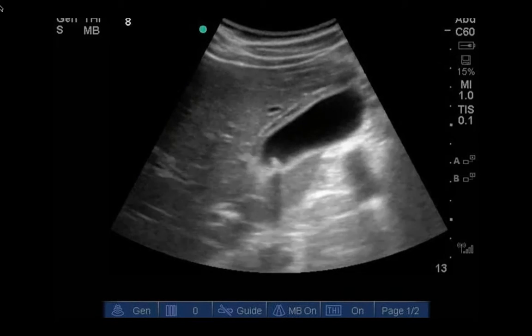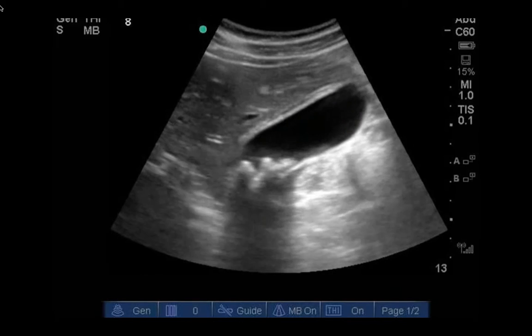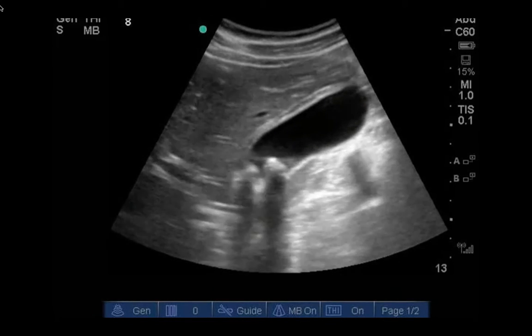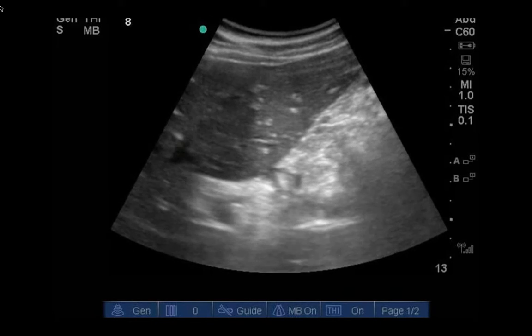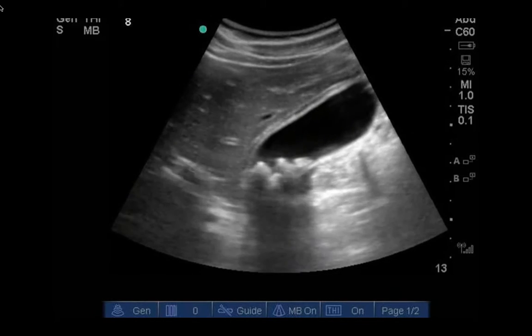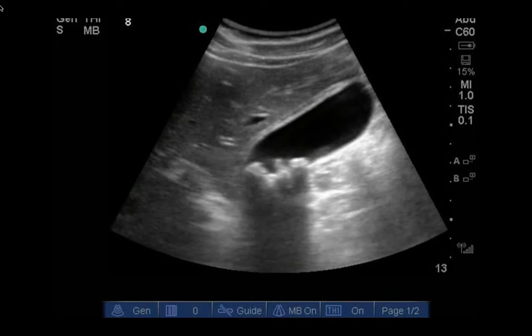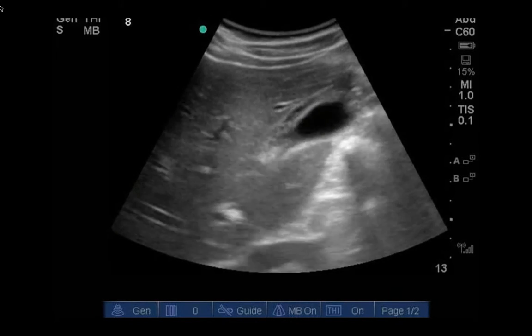And here is yet another example of acute cholecystitis. You can imagine that if you see this on bedside ultrasound, your workup now becomes much more streamlined as you have a diagnosis made. Remember that at Maine Medical Center, at least at this point in 2015, a confirmatory study done by radiology is always required. However, this is not the case at many other facilities and may not be the case at Maine Med in the future. So it's important to learn the skill and be able to identify such pathology.